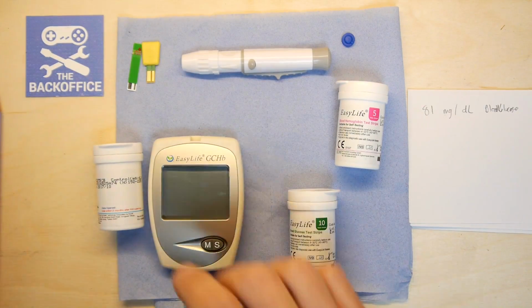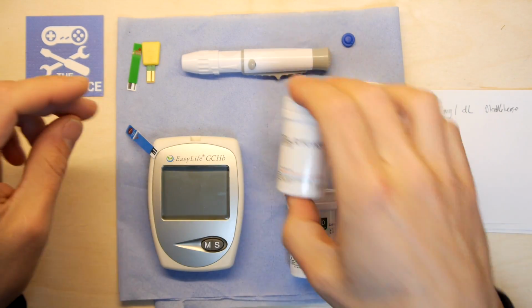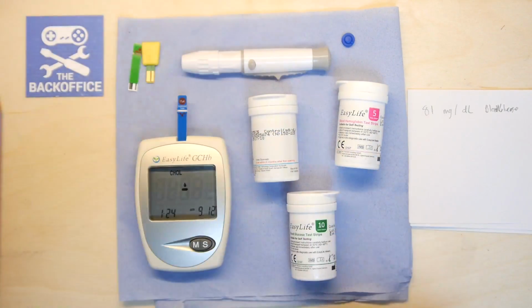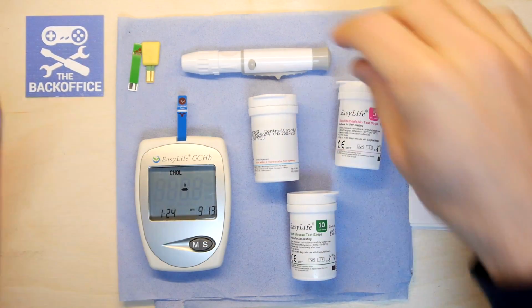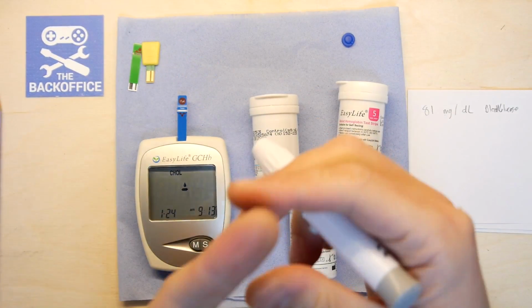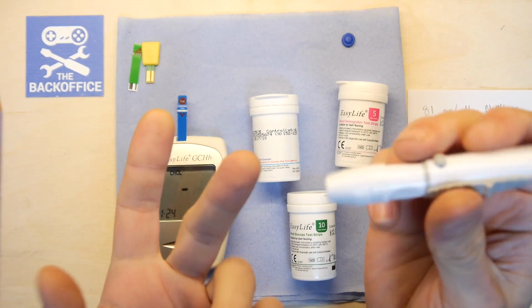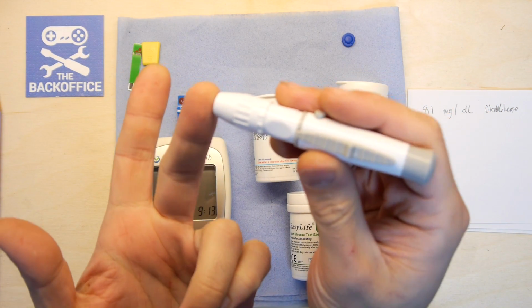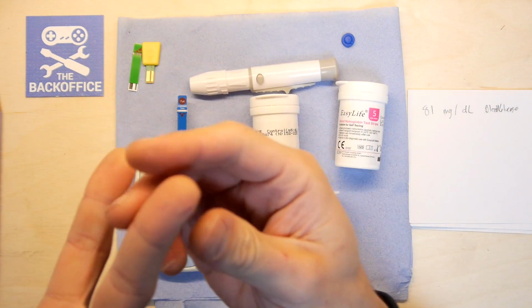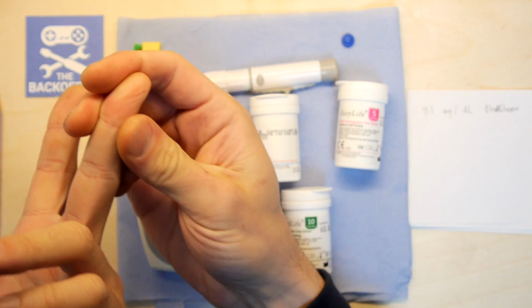Okay, it's taken some time to get some advice on this, so I've basically been whirling my hand around and flicking it, flexing it, this and that, and putting it in warm water. So come on, and they say actually also have a go at pricking it on the side of the finger. You know, let's prick the side of the finger. I don't know if I have to try a different finger now. That poor index finger is getting a pretty mullet, so I'm going to go for this one. Come on now, come on, hit me. Oh, that hurt. I say hurt, not hurt. Side of the finger.